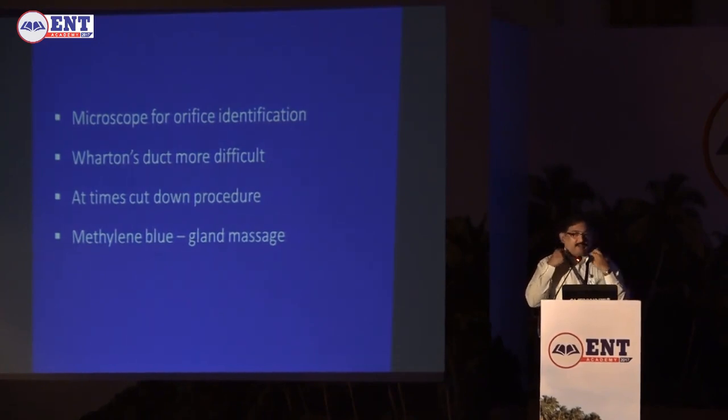Between the two ducts, parotid and submandibular, if you are going to do cases by yourself, start with submandibular because the duct is long, it's more forgiving. The only thing is, it is more difficult to enter. Parotid duct is easy to enter, but more difficult to manipulate. You imagine your patient of nasal endoscopy floating in water, and you are putting an endoscope into the nose when he is freely floating, and you want to go here and there. Wherever you twist, the body will twist. The scope won't go, like you want to go into the sphenoid, you just go in.